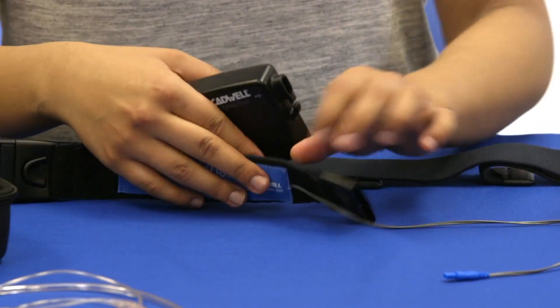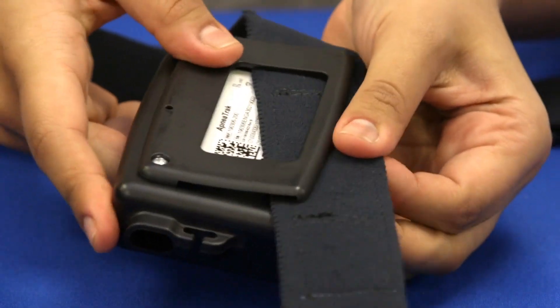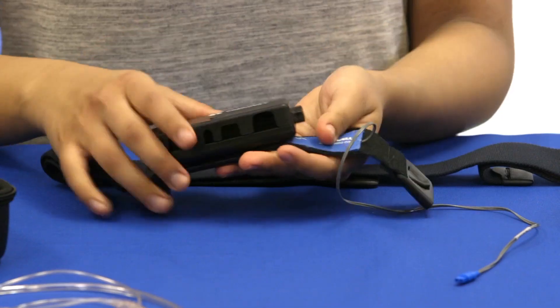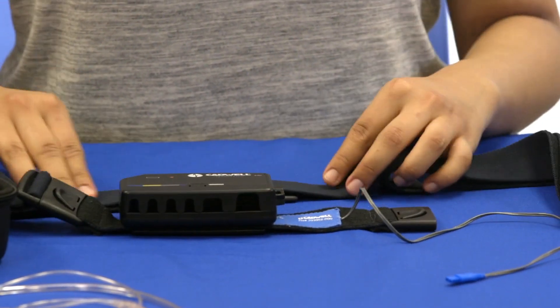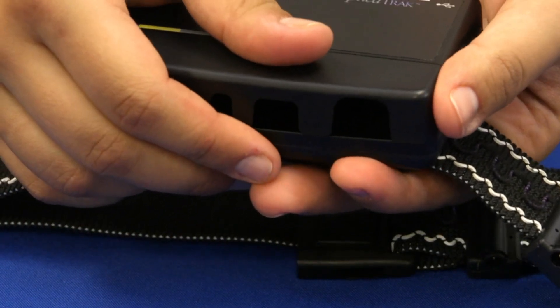Orient the text on the belt and the text on the apnea track facing up. Connect the apnea track to the chest belt near the buckle by sliding the belt up under the clip on the back of the apnea track. To remove the port cover, press on the arrow and slide the panel down.